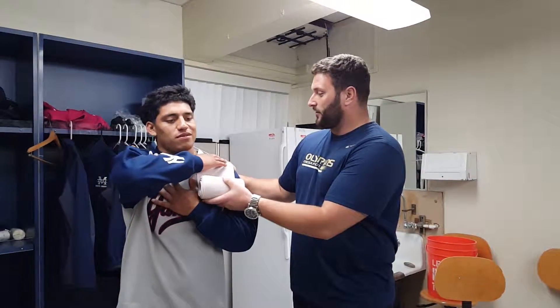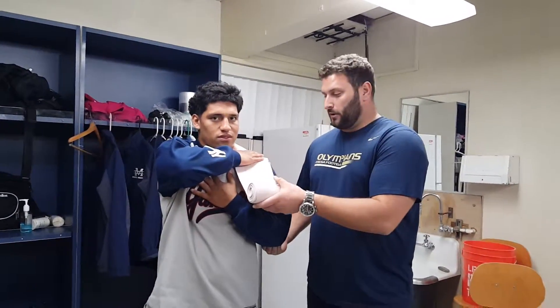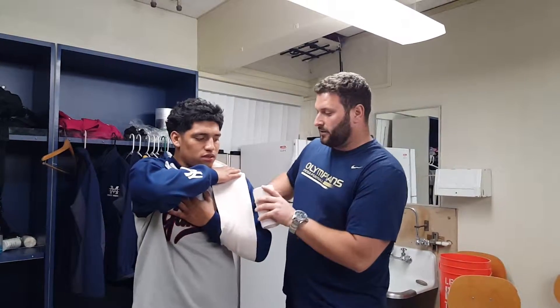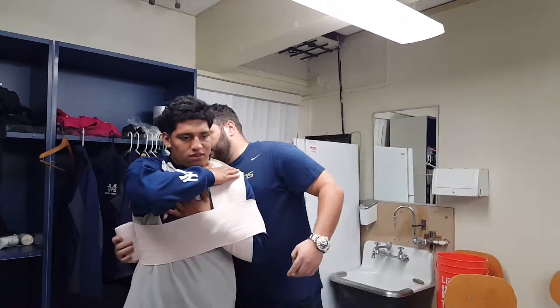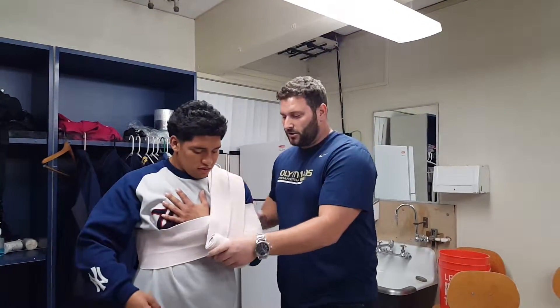We'll begin by placing the wrap on the shoulder. I'll ask the patient — Abraham, will you hold this with your offhand please? We're going to work in a downward motion. We're going to have a flexed elbow and work around the elbow, keeping the ace bandage tight. We're going to work around the ribs and go back over the top of the shoulder and repeat that hooking motion.